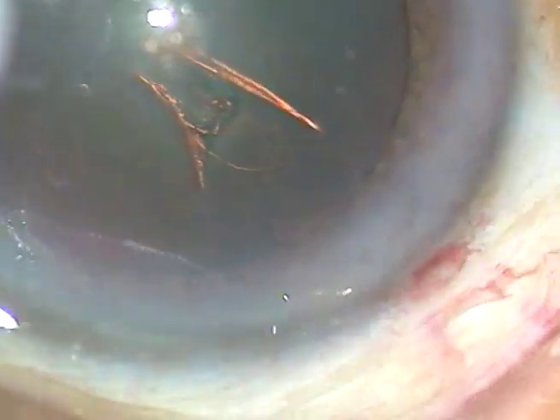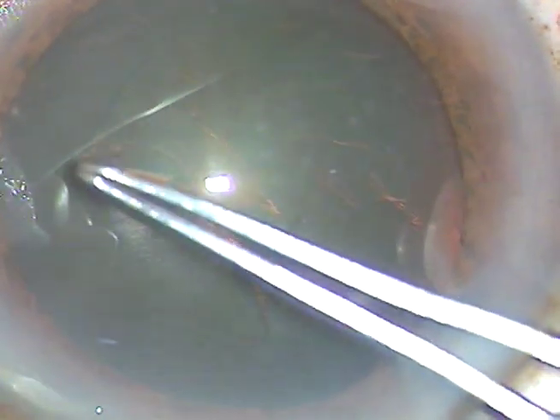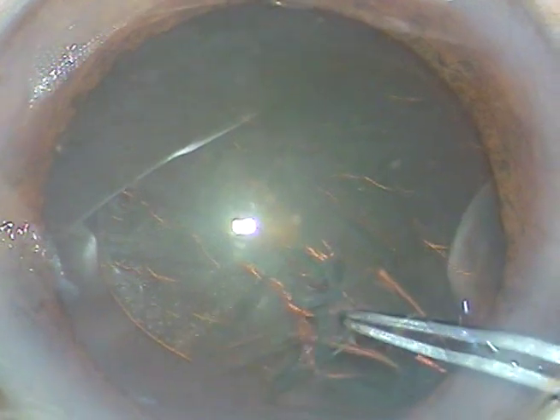I am finding it difficult to keep centration. By this time, viscoelastic substance has been injected into the anterior chamber. The anterior capsule has been incised with a 26-gauge bent needle. Now I am using utrata forceps to do a continuous curvilinear capsulorhexis, and here is a complete rhexis.